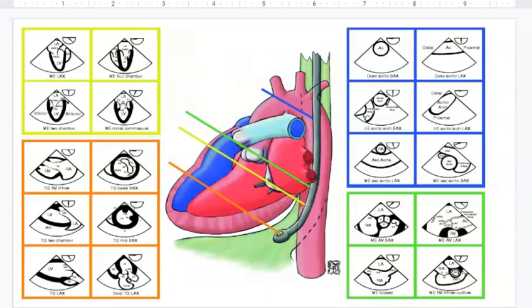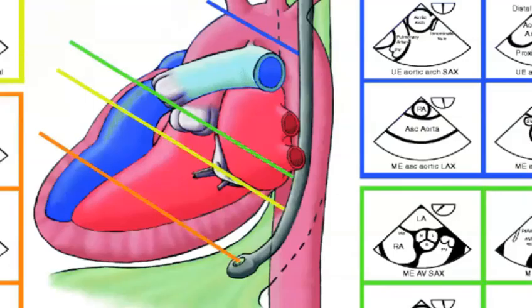You can see the probe there where it flexes, both anteflexes and retroflexes, and it also goes side to side. And of course, the physician can manipulate it by hand to get the image they need. And there's an angle box in the screen, and I know it's hard to see right here. Let me see if I can make this a little bigger.